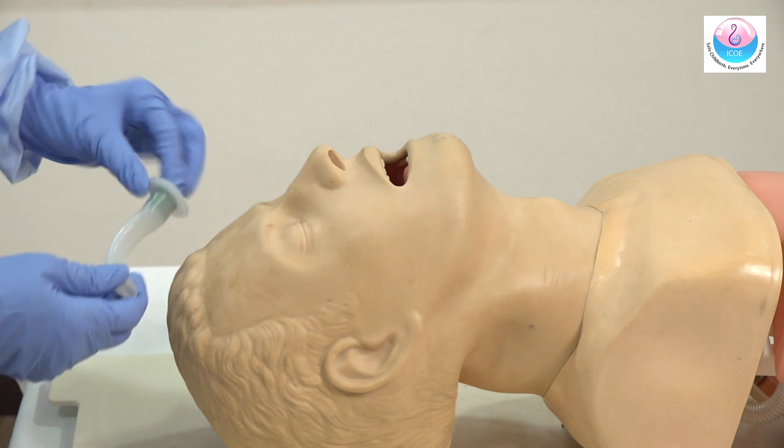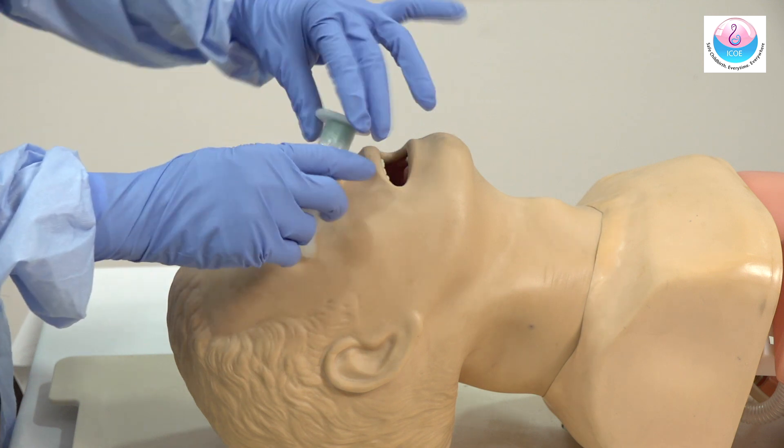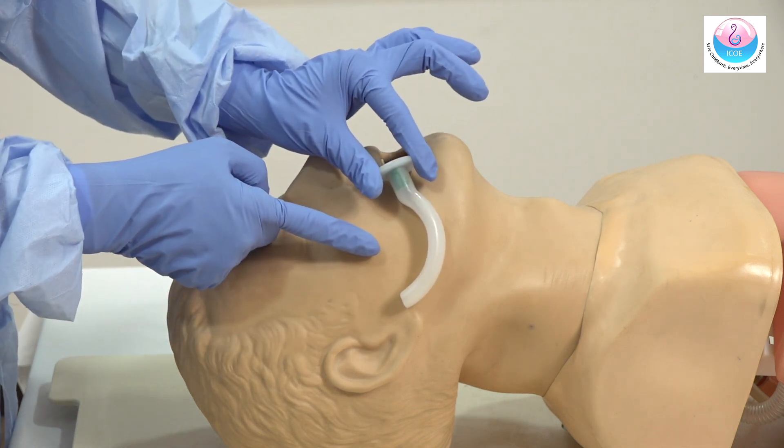Select the appropriate size of the oropharyngeal airway. This can be measured by placing the airway next to the cheek and measuring from the corner of the mouth to the angle of the mandible.